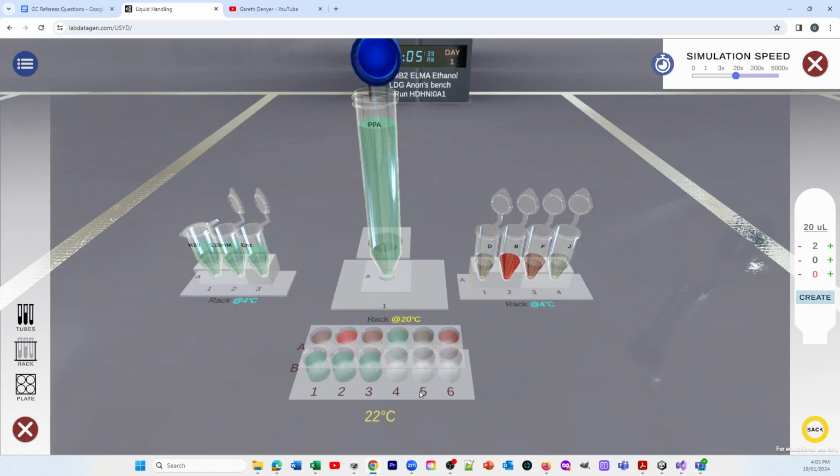Now, even without measuring any numbers at this stage, we can see very clearly that the 5 and 10 microliters that we put in these 2 wells here have produced a colour, and there's colour from these 3 drivers here. There's no colour from driver J. So even without getting any numbers, we can probably surmise that driver J hasn't drunk any alcohol that evening, but driver B is looking pretty bad, and drivers F and D, well, they've clearly had something.